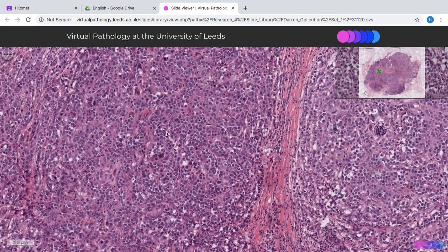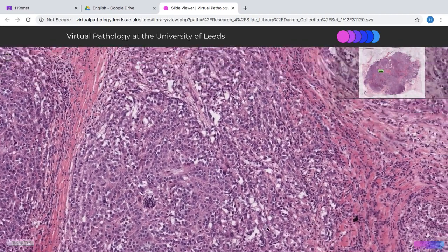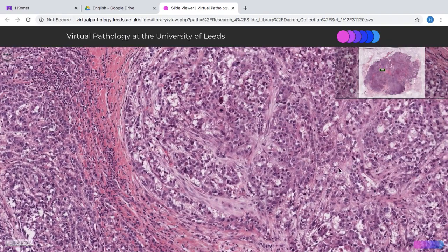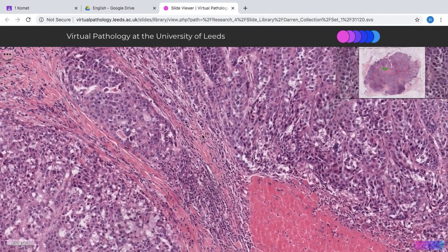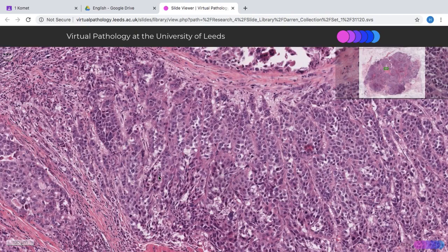What is striking is wherever you go, you hardly see any tubule formation. That's an important criteria when you are reporting a primary breast carcinoma, because the grading for breast carcinoma requires you to identify and quantify the amount of tubule formation present. We give that a tubule score, then look at nuclear features for a pleomorphism score, and also count mitoses for a mitosis score. You then add up all the scores to stratify or grade the tumor into either grade 1, 2, or 3.